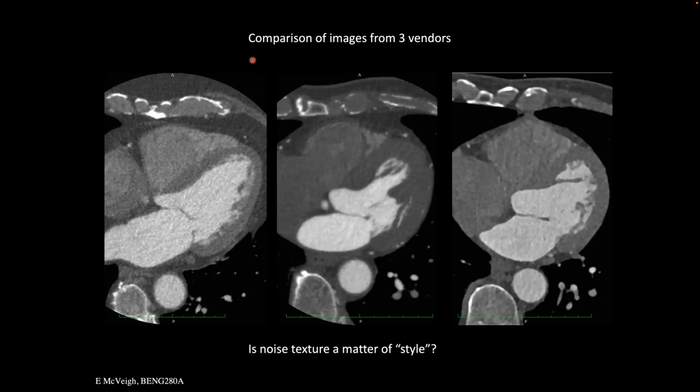So if you look at those, I'm going to ask you a simple question. If you were to use one of these images to image the heart, just from the appearance of the image, which one would you choose? Which one do you like? Everybody has to vote once, okay? How many people would like to read this image if they were asked a problem like: look for the coronary vessel. Is the coronary vessel open? This is a coronary, this is a coronary, and that's a coronary, right? This is a coronary here, right?